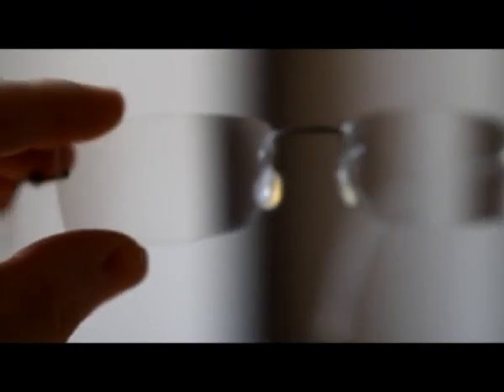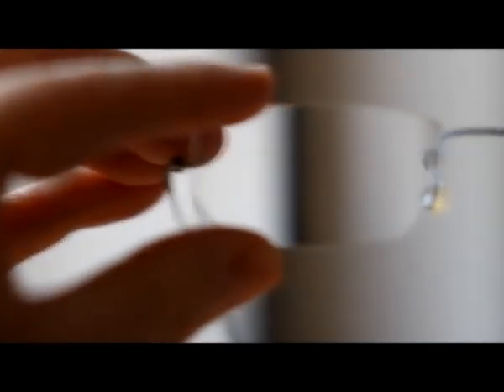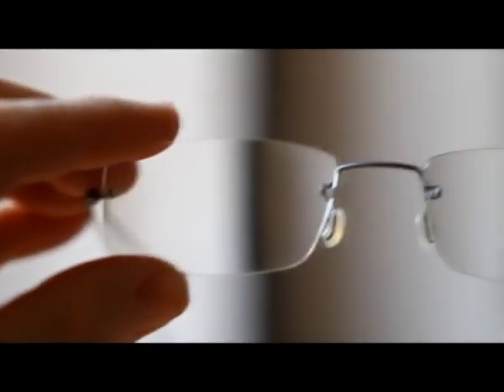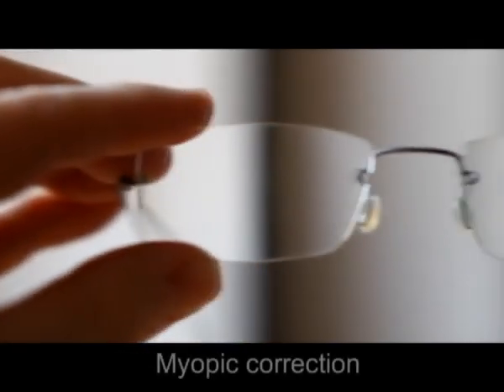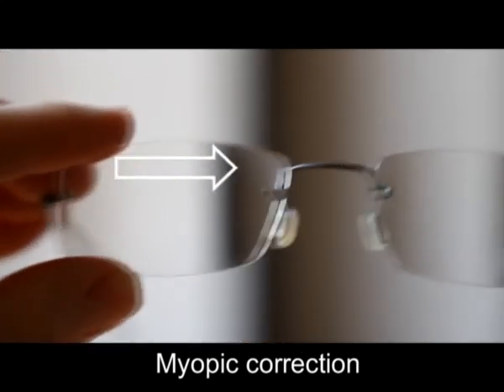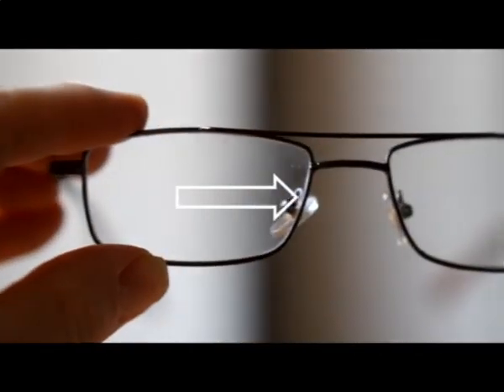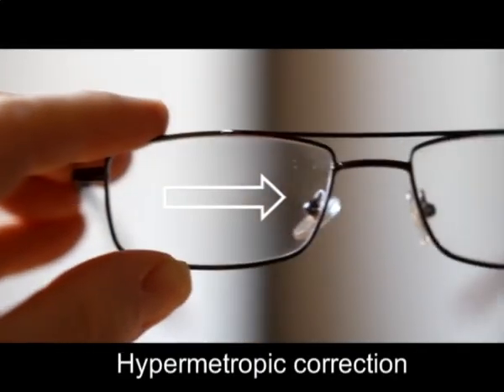One other way is to pick up the spectacles as if you were picking them off the patient's nose, and to hold them at arm's length, looking at a target through the lens, for example the edge of a table or a window frame. Then move your hand horizontally in a left and right direction. If the image seen through the spectacles moves in the same direction as the hand movement, then the spectacle lens is a myopic lens. But if the image seen through the spectacle lens moves in the opposite direction to that of the hand holding the spectacles, then the lens is a hypermetropic correction.